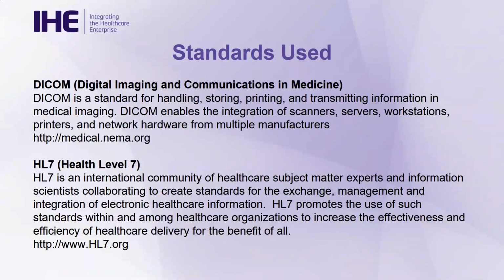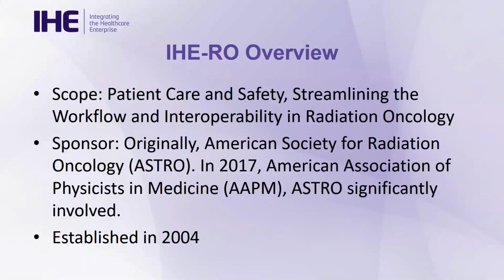Also, DICOM has a number of tags that are optional, but IHE will take a look at the DICOM standard and refine it. I do want to emphasize IHE doesn't create standards. What I think of it as is a refinement of the existing standards. And once again, in IHE-RO, we focus mainly on the DICOM standard and do our best to enhance that.